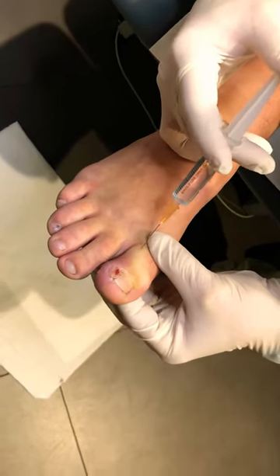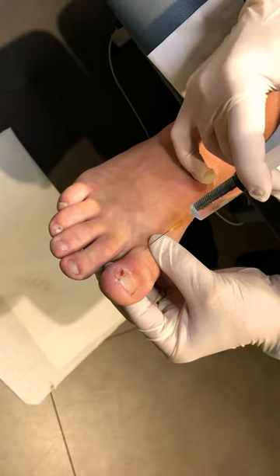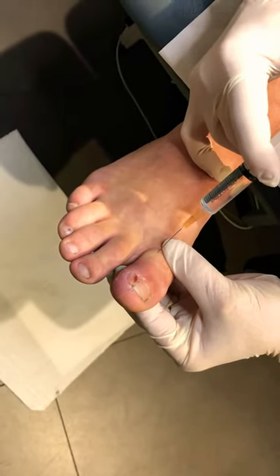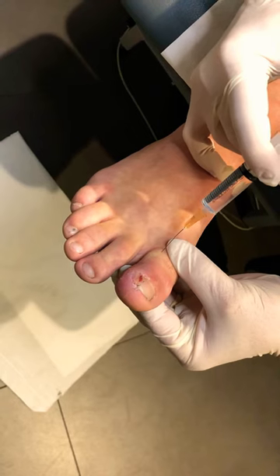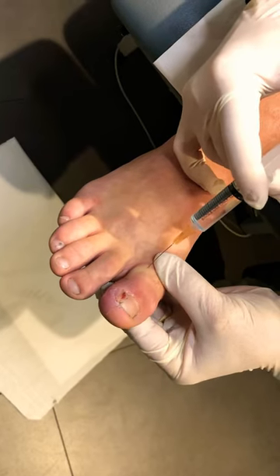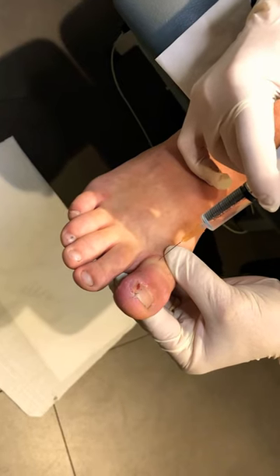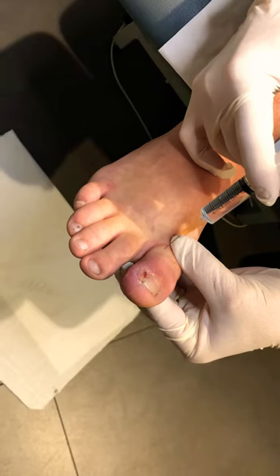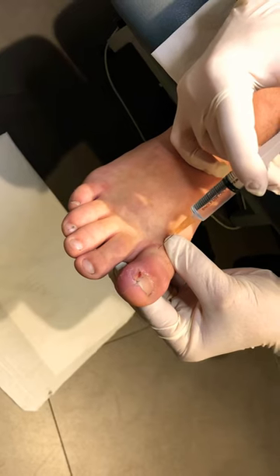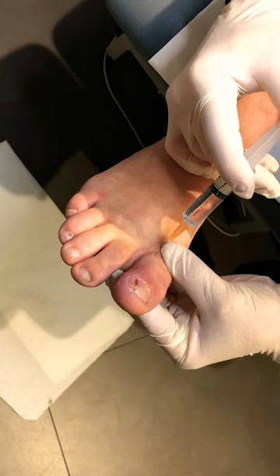Is that gone now? Now what we feel is a bit of pressure. Just put some local in to sort out this top nerve. Once we're happy with that, we can actually knock out the bottom nerve as well. Just let me know if you feel anything that's uncomfortable, so we can feel where that is — we'll knock out that second nerve there.